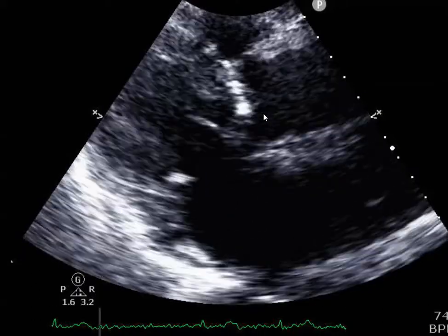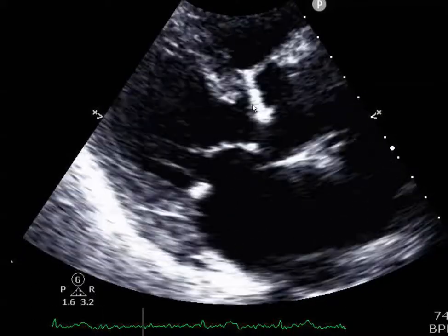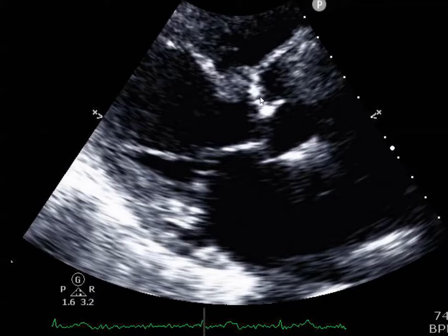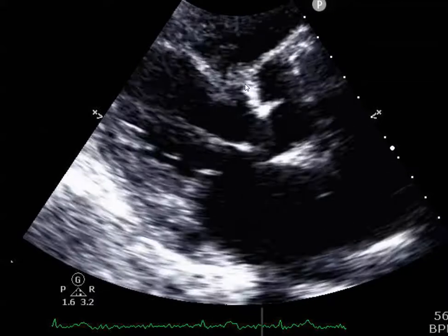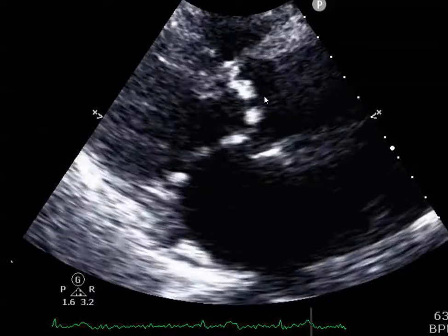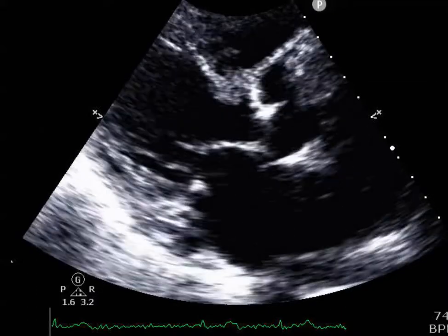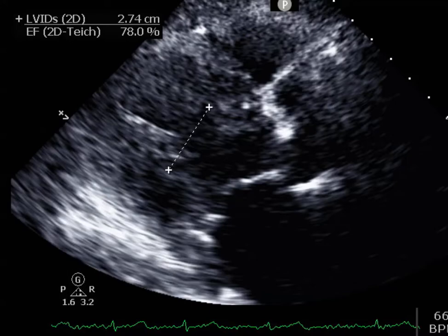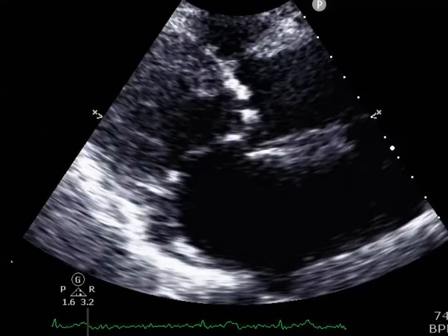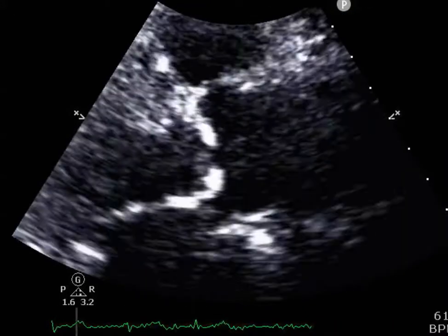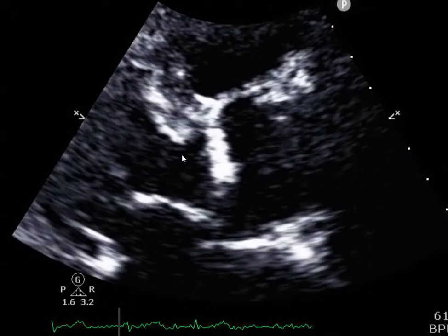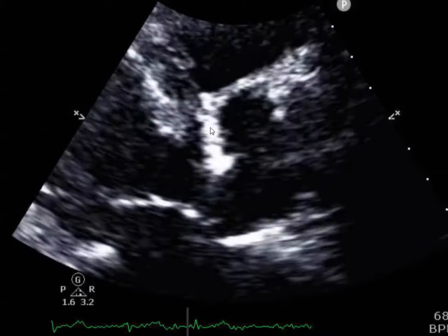It kind of looks like it's doming in systole. Let's take a look at the close-up of it — right here, doming.